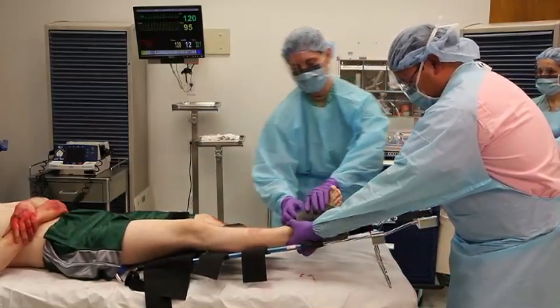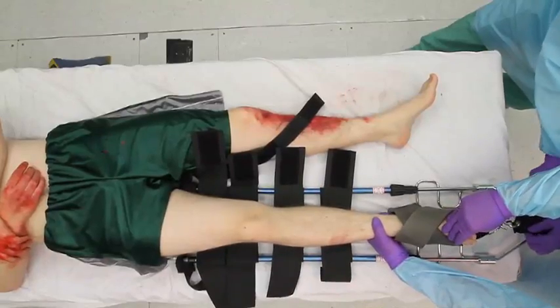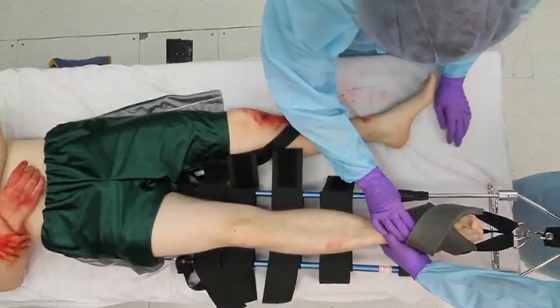Apply traction in increments using the windless knob until the extremity appears stable, or until pain and muscle spasm are relieved. Again, assess the neurovascular status of the injured extremity.